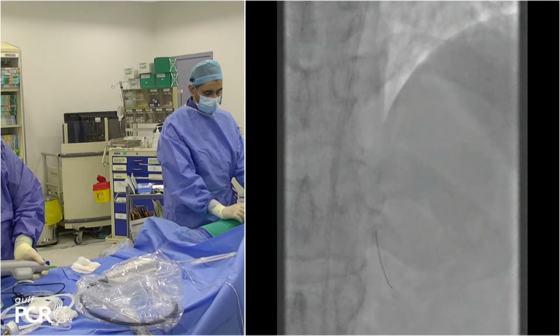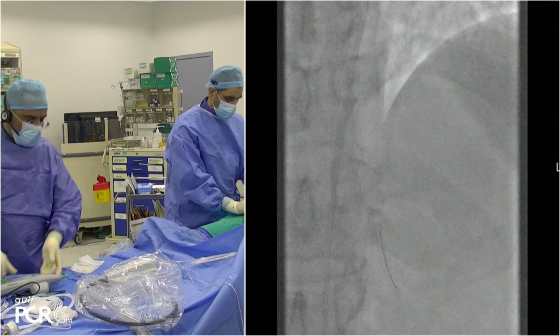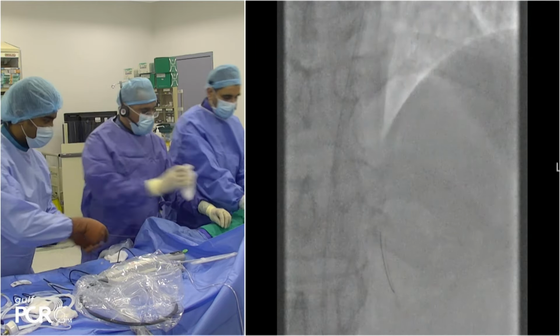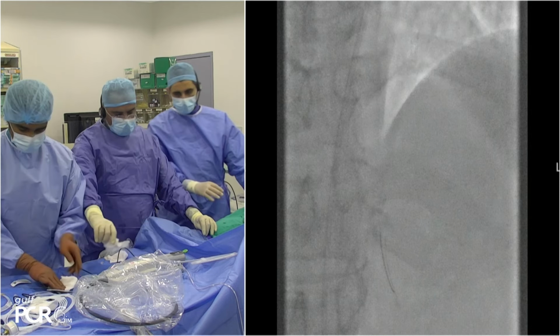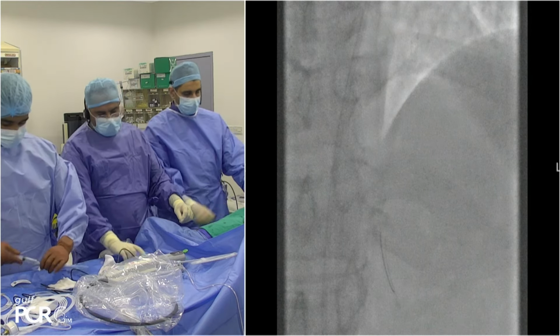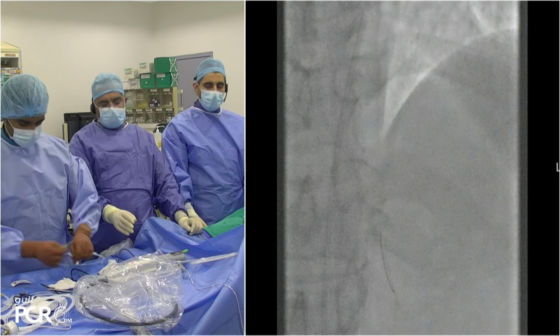Yeah. And I'm just going to share one other thing about the orbital atherectomy, which contrasts to the rotational atherectomy, that it's not only the shaving that it does, but also that with the orbital movement, it does give you like the jackhammer effect, in which it could break the calcium as well. So it's a dual action mechanism that you could have with orbital atherectomy.